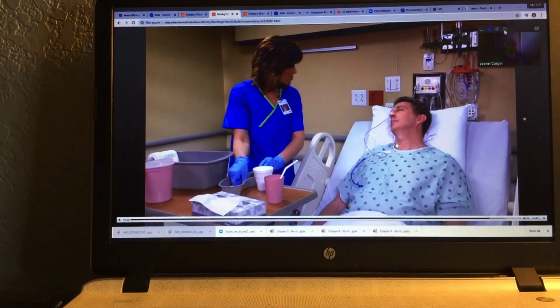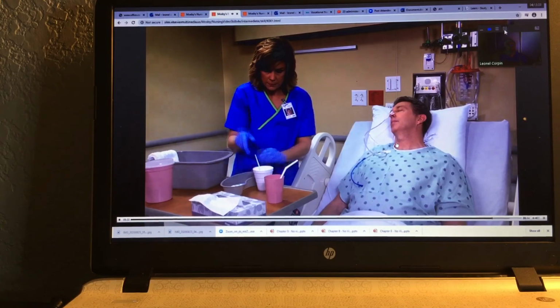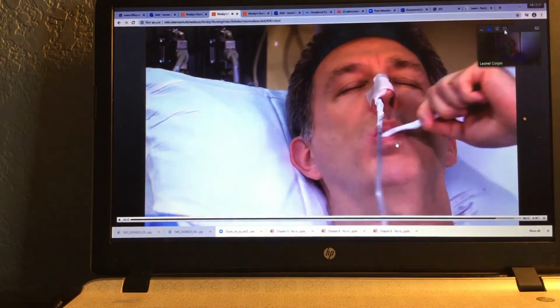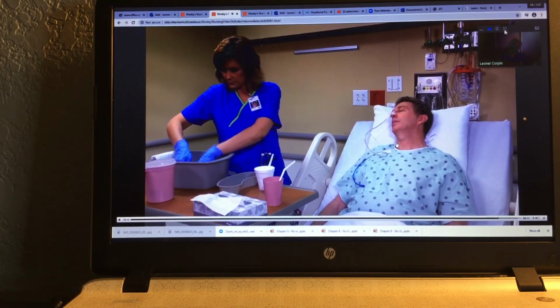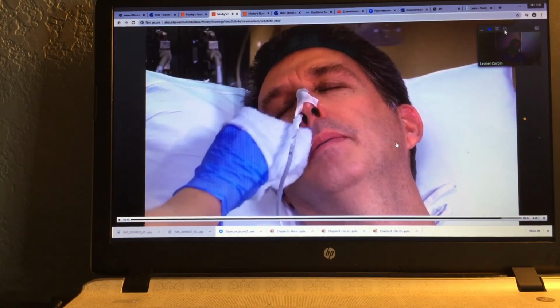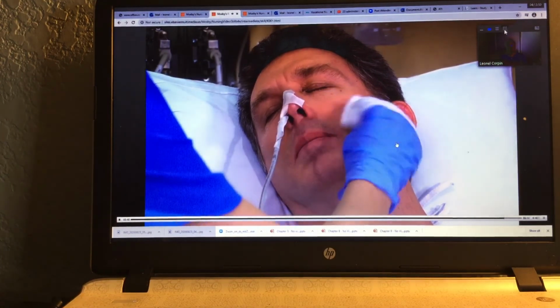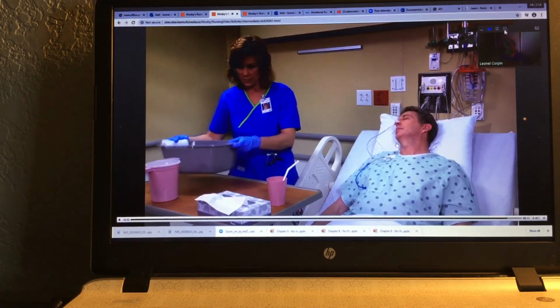All right, we're going to do some oral care now to hopefully make you feel a little better. Sir, wearing clean gloves, provide oral hygiene. We're going to clean up around your nose a little bit now for you, sir. Clean the tubing at the nostril with a damp washcloth and mild soap. Dispose of your used equipment. Call me if you need anything.